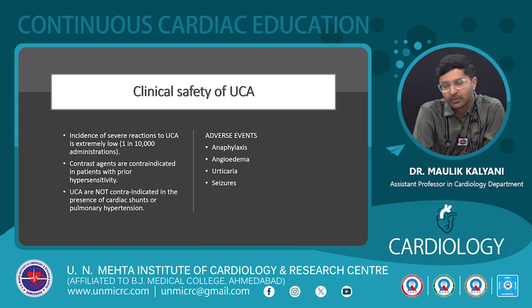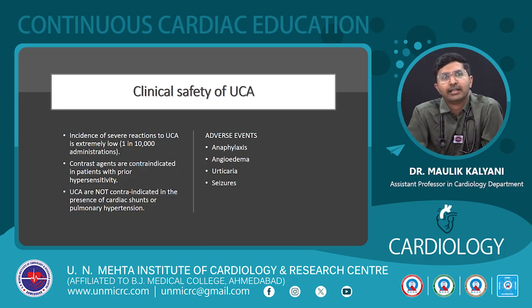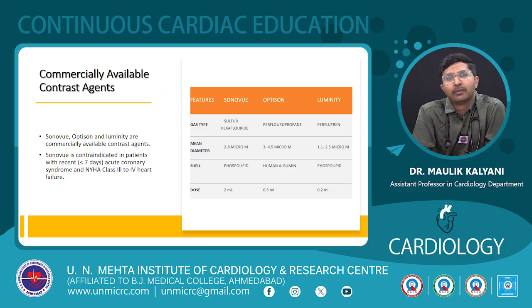So, regarding the clinical safety of the ultrasound agent, severe reactions are extremely rare, about 1 in 10,000. It is contraindicated in patients with hypersensitivity, but it is not contraindicated in the presence of cardiac shunt or pulmonary hypertension. There can be anaphylaxis, angioedema, urticaria, and seizures, as can happen with any drug.